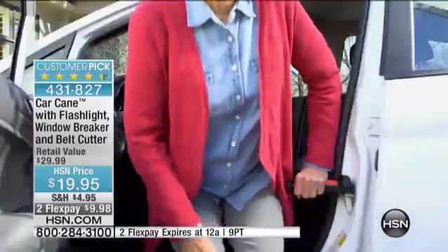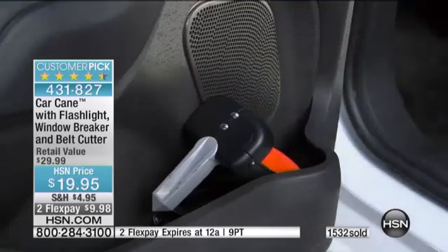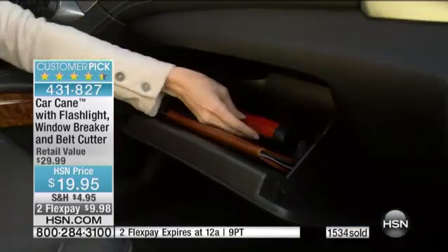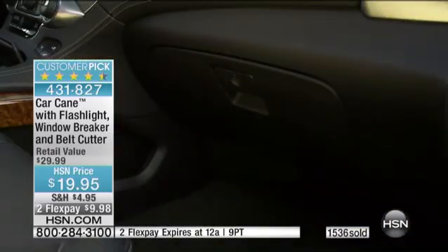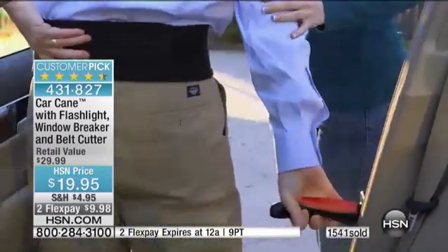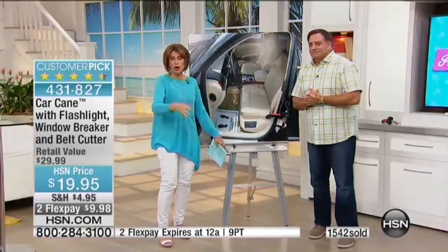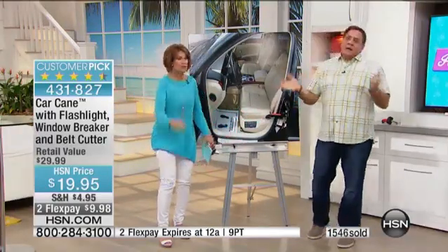But what you don't want to do is take that little strap, the little hook that comes down, the handle that's supposed to hold your clothes or whatever. I don't even know what that thing is. You don't want to do that, or balance on the door, because you know what happens, and maybe it's happened to you. That door closes, and it closes on your knee.